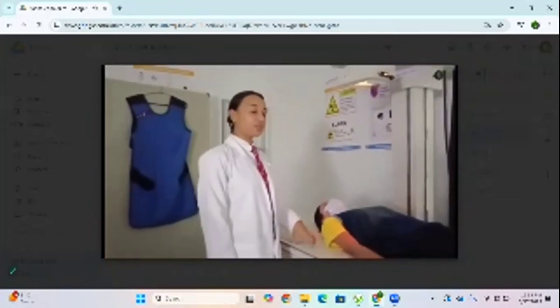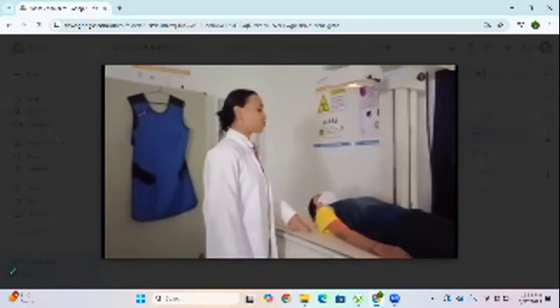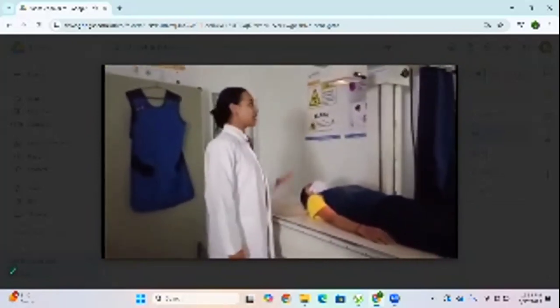This is another way through which we can obtain the image. In this, the patient will be lying on the bucky and the X-rays will be falling onto the body. So this was my last demonstration video, and I hope that you all have got a clearer view.